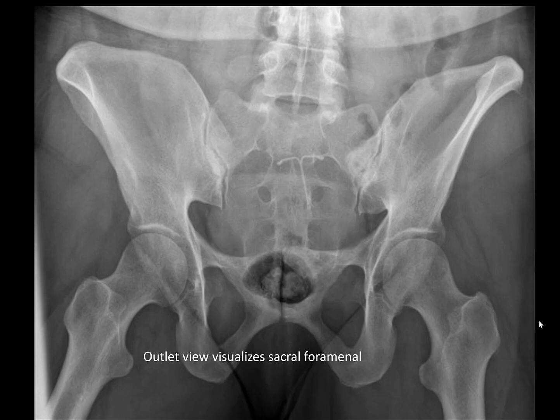Go grab a pelvic model and see the thickness of the bone just anterior to the SI joint. That's where all of your weight gets transferred through. This is real bone because the axis of weight bearing is just like that. It's a line from the femoral head right up into the sacroiliac on the same side. There's very little weight bearing depending on your anatomy. Now, there's a lot of variation in your sacral anatomy. But fixing it here with screws, trying to get a good bite at S2, in my experience it does not have a good bite, and you don't get good fixation.